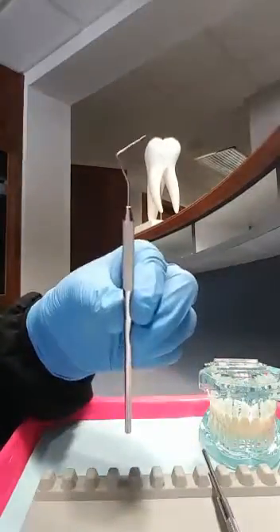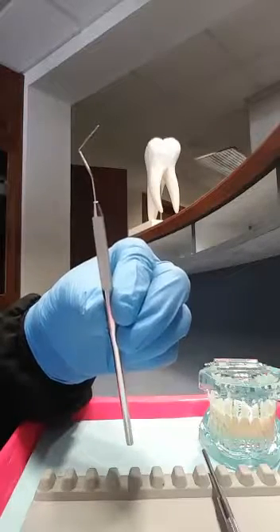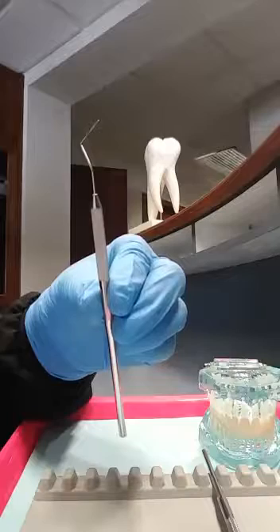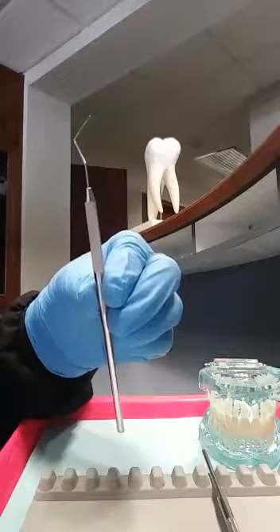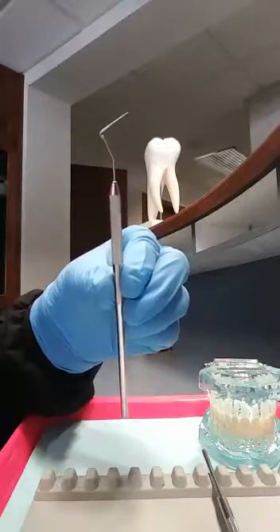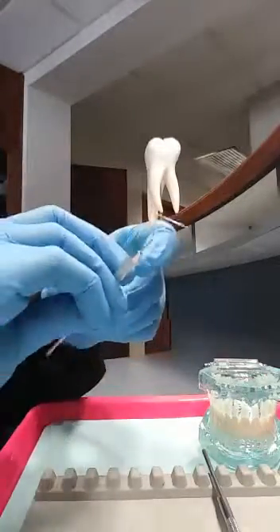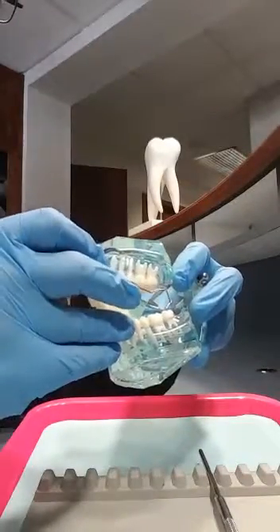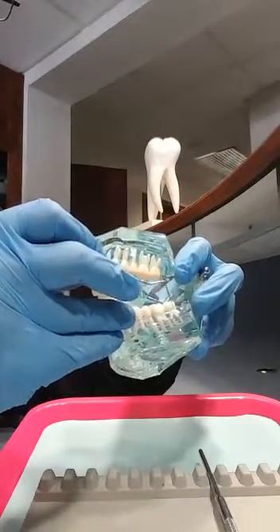They have a flat or rounded end and they have millimeter increment markings on each and every style of the periodontal probe. The dentist or the hygienist will walk this very gently under the gingival sulcus.